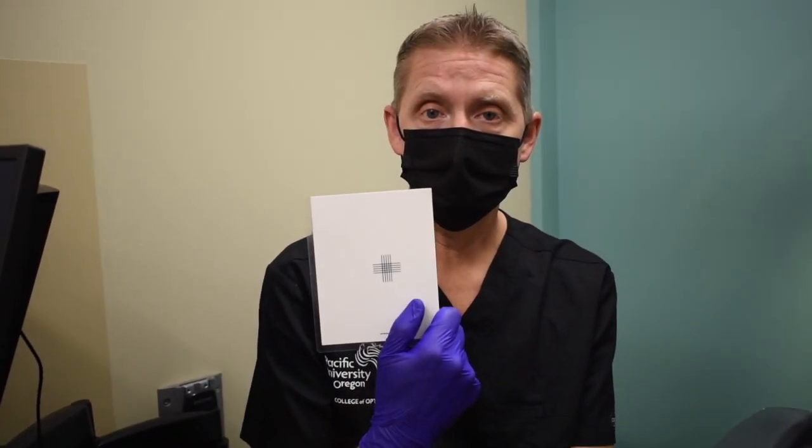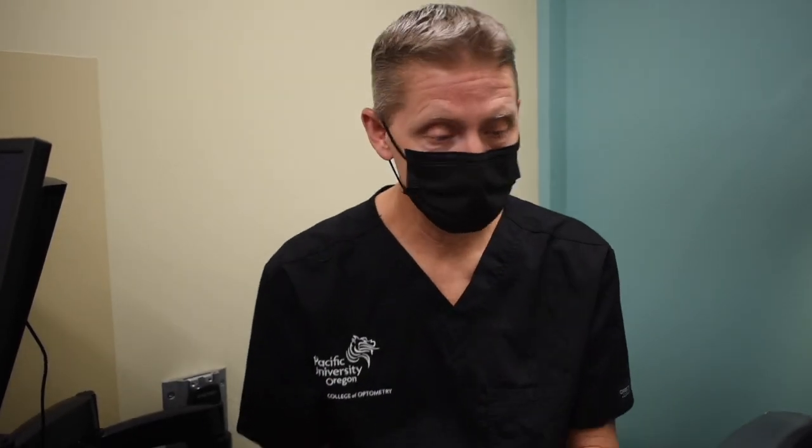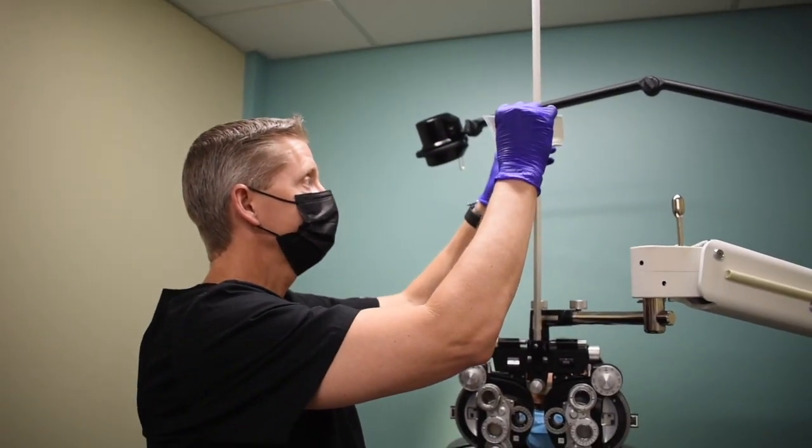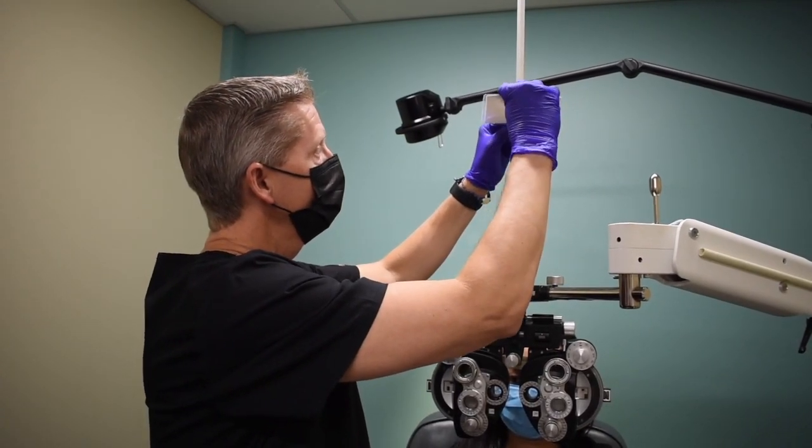For this particular lab, you'll need your diamond card that on the back side has the cross cylinder grid. Once you get in the lab, you'll go ahead and place it or position it onto your foreopter.